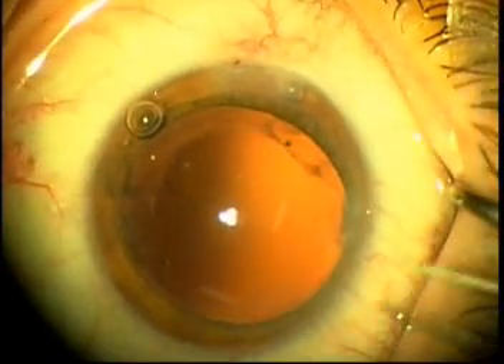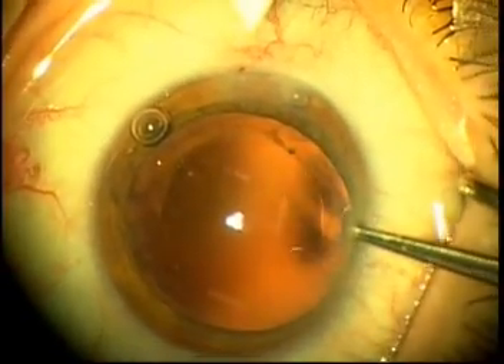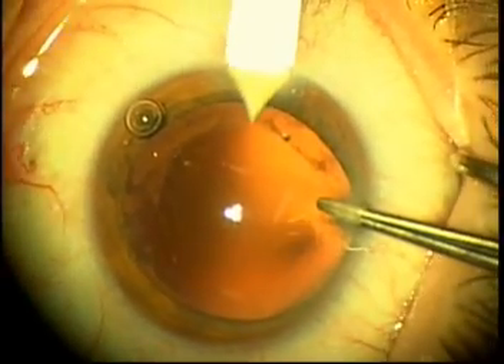Hi, my name is Dr. Peters and I'm going to demonstrate a new technique to inject the Acreos lens through a 2.8 mm incision into the capsular bag.